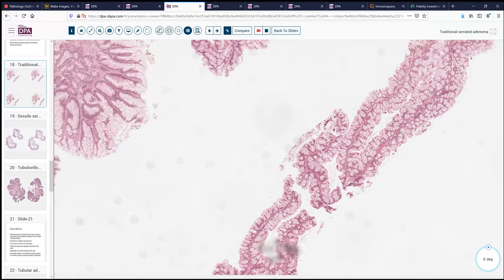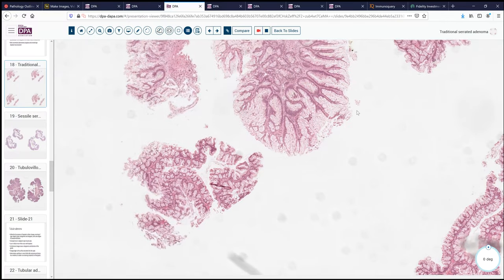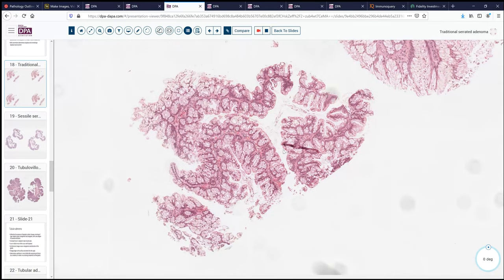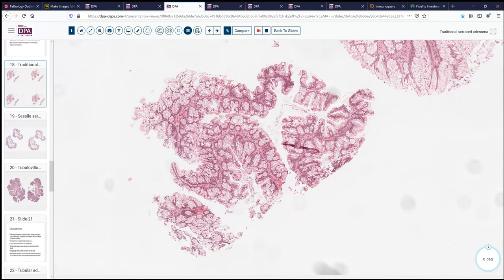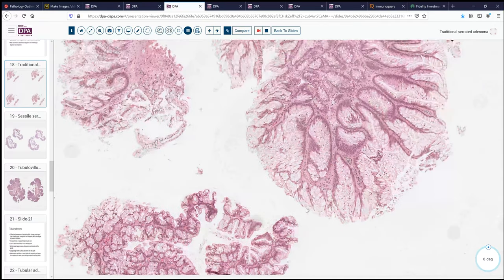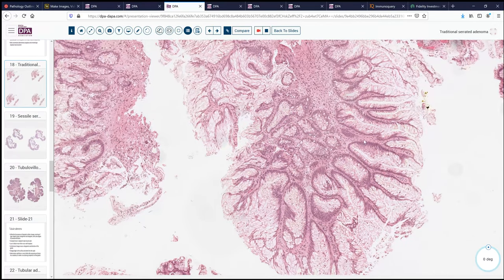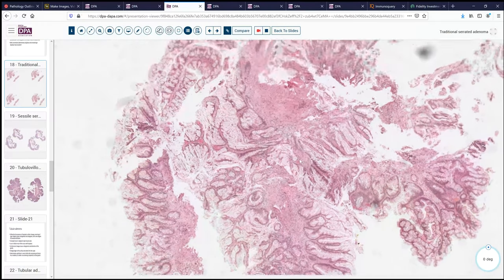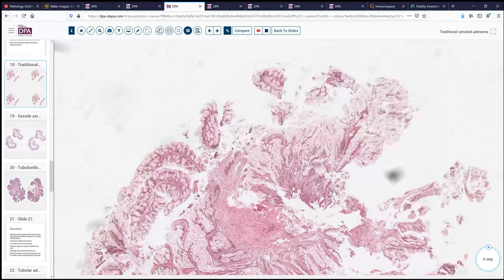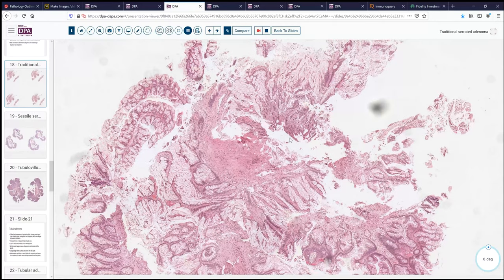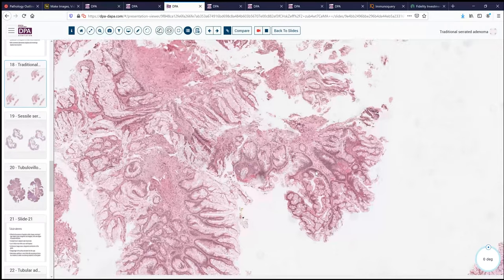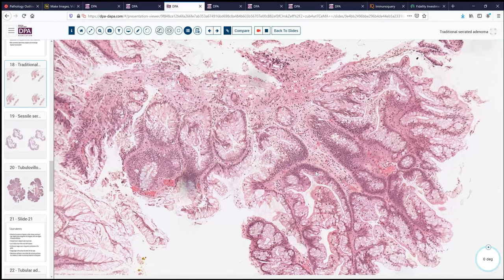Looking further at this case, we'd want to ask whether there is any evidence of dysplasia. In this fragment, we see nice mucinous epithelium without features that look like dysplasia. This lesion is somewhat cauterized, and that can sometimes begin to look like nuclear stratification and dysplasia, which becomes a bit more problematic for evaluation. However, in the absence of unequivocal dysplastic changes, one would classify this as a traditional serrated adenoma without unequivocal evidence of dysplasia.